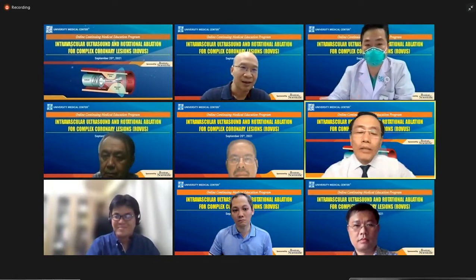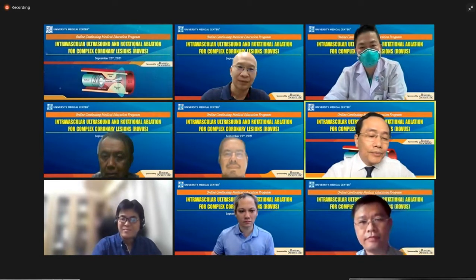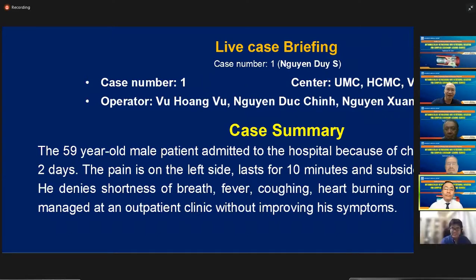Thank you, Dr. Kuramitsu. Now we move to the live case. Now, UMC DSA staff, you can start your case. Good everybody, welcome to the live case today. I'm Dr. Vũ from UMC, and this is Dr. Vinh from UMC, and this is Mr. Nick, head nurse of the cath lab. Let me introduce the case. Dr. Vinh will introduce the case, please.